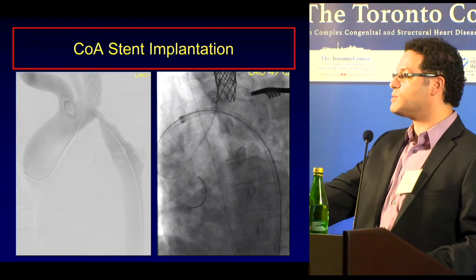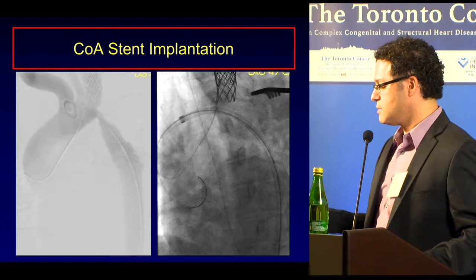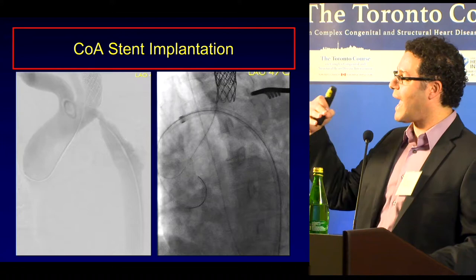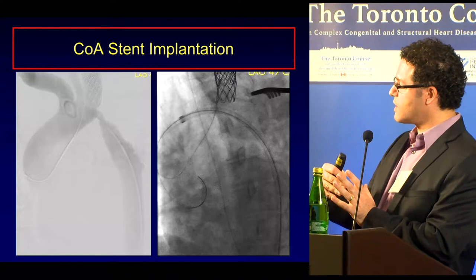So we've now sealed that. We're now in a more stable place, and that's where we were at. So would you consider a bypass, a carotid subclavian bypass or anything like that? We were considering all of these options, that you could seal the left subclavian completely, and then you could do a carotid to left subclavian bypass. The fact that we had access from the left axilla, if we sealed it completely, you can perforate through the side of a covered stent, open and fracture that opening so you aren't actually jailing it.